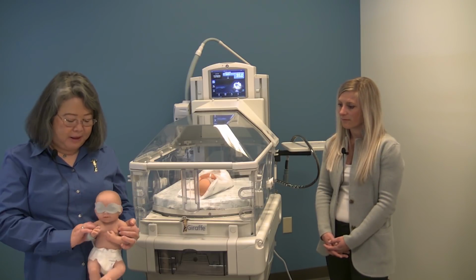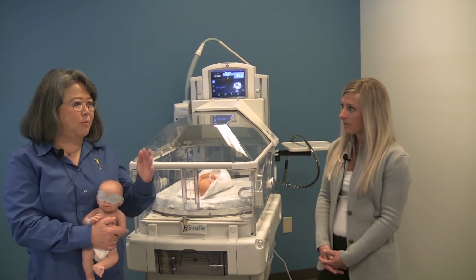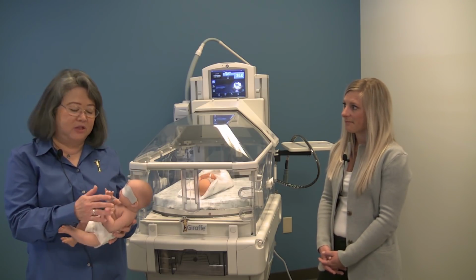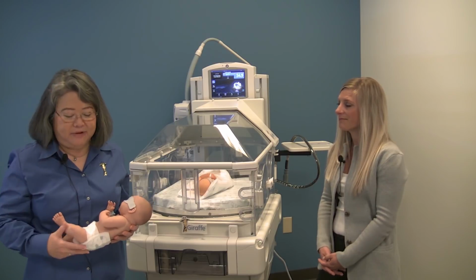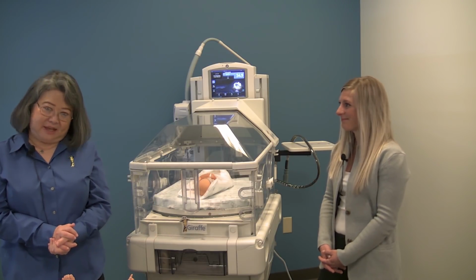I know you do that, but definitely we do recommend using eye patches regardless of which phototherapy units you use, just because the baby is so active and we need to protect their eyes, and you don't know when they're going to have the eye patch be skewed and not covering perfectly. So 100% of the time, I would say yes.